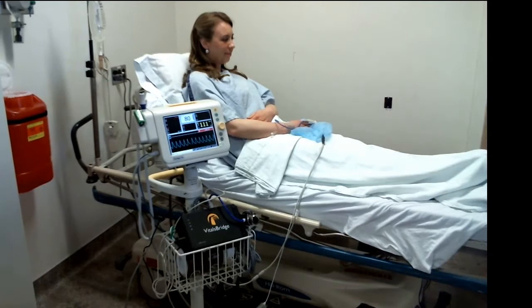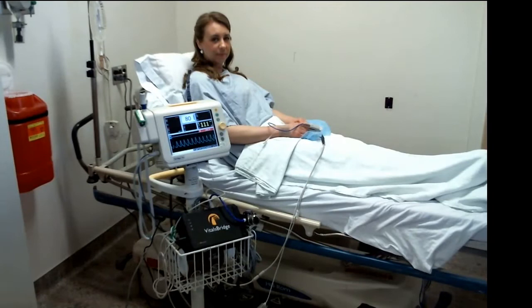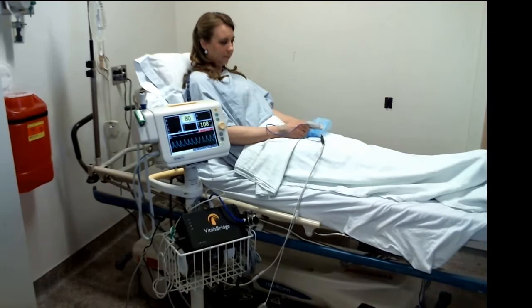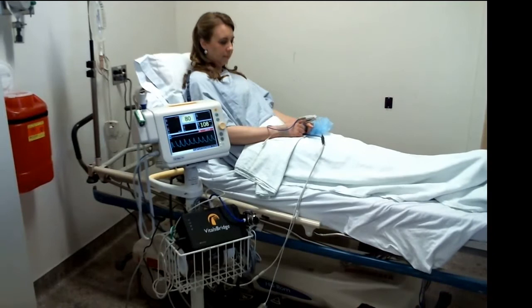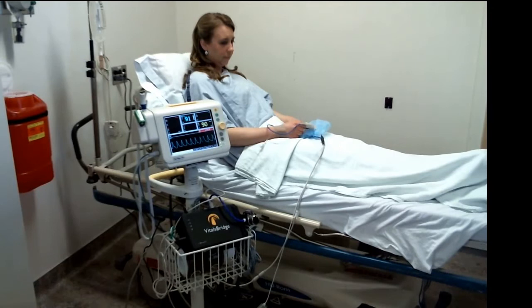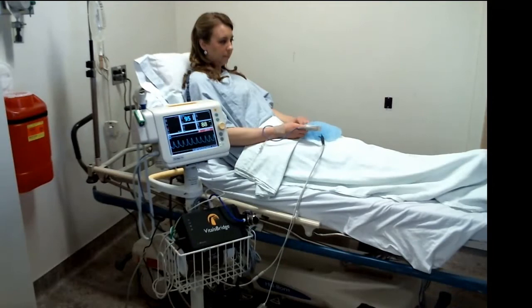The simulation begins with the team setting the standardized patient's vital signs back to normal using the LEAP software. Even though a patient monitor is in use, all parameters are being set through LEAP. As Noah updates the LEAP software, you can immediately see the reflection of that data on the patient monitor.